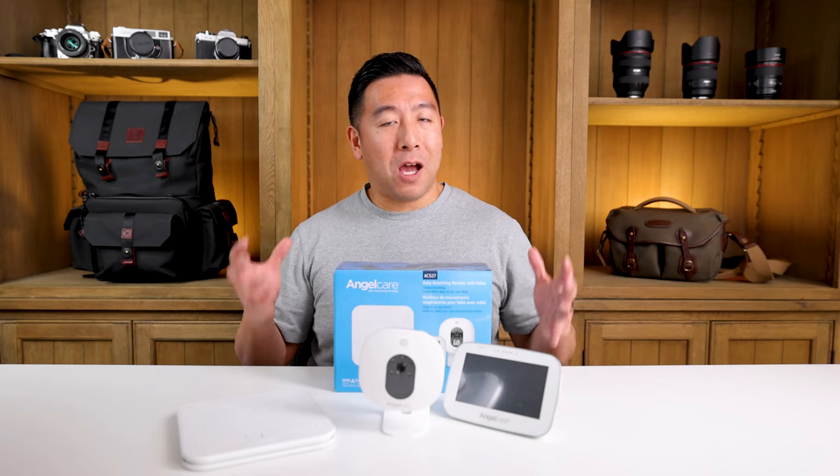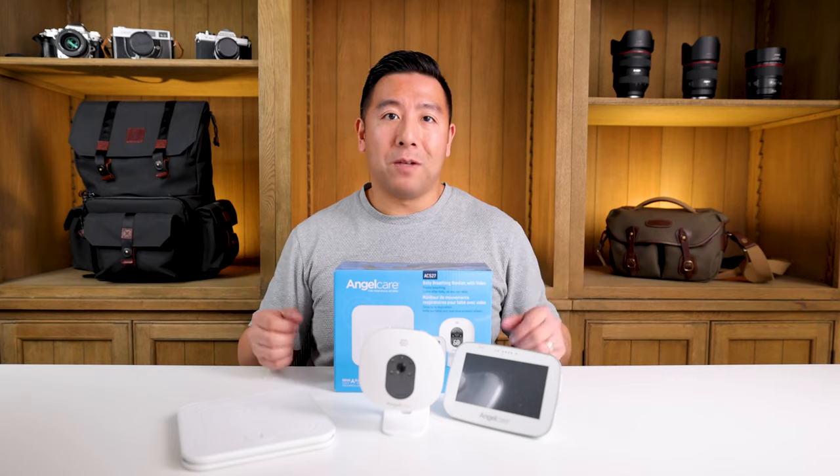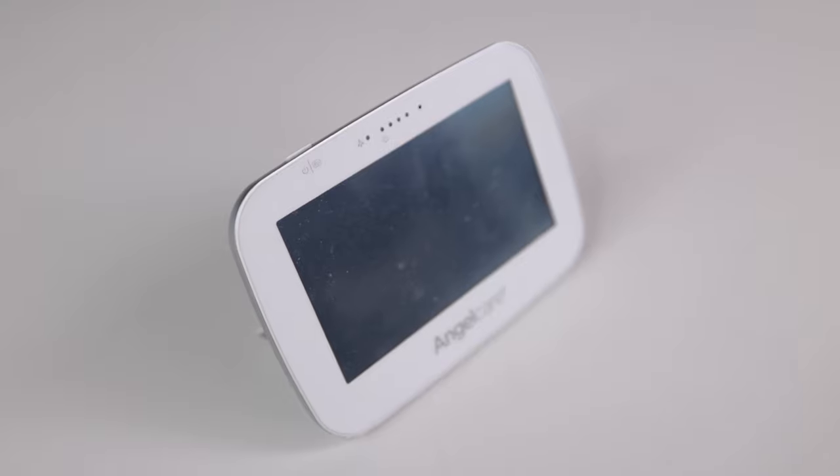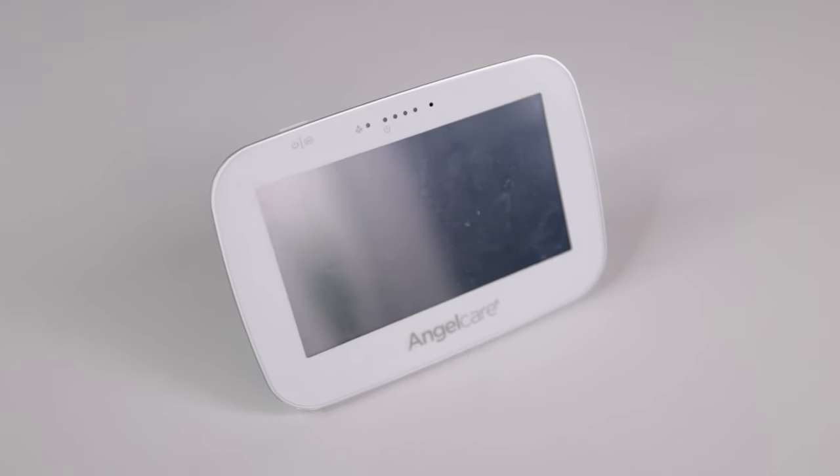It is annoying and it takes some time getting used to. I've definitely forgotten it many times, but eventually you get the hang of it. First of all, it is touch screen, and it is the worst touch screen I have ever used on any device.